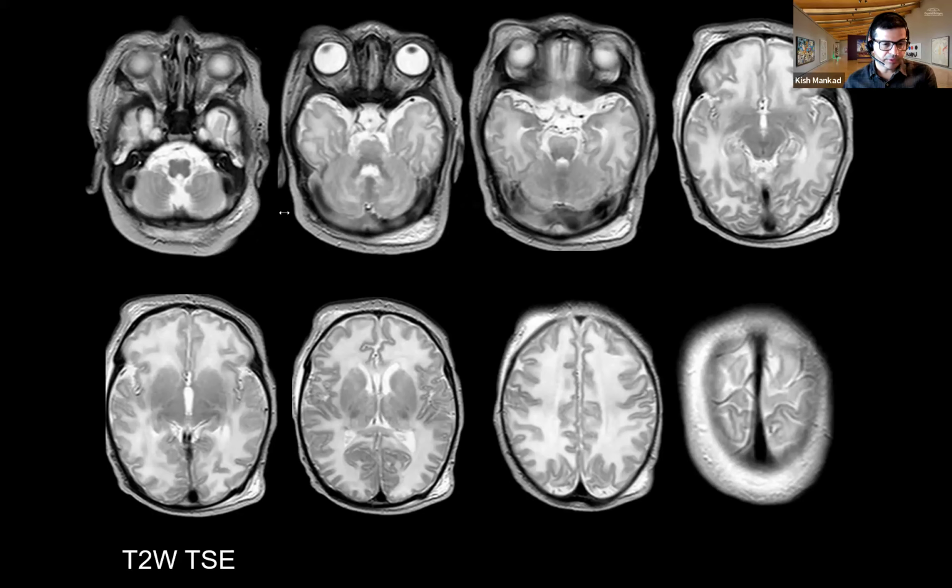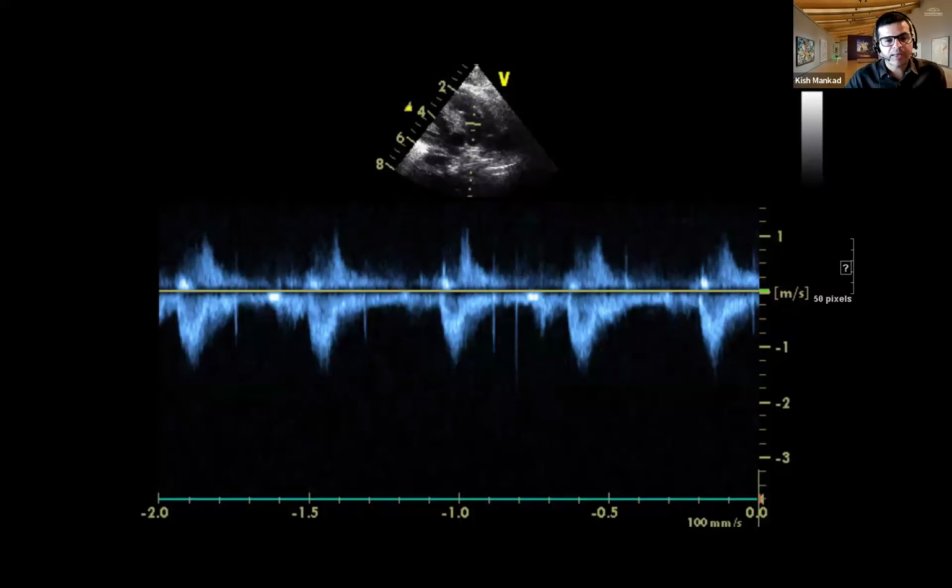And DSA, Dr. Sami said, digital subtraction angiogram is a very big undertaking. Any simpler test before that? Anything you could do on the bedside? And that is very important to remember because in neonates, you have a lot of potential with this modality of imaging. The answer is yes, ultrasound. And I think Dr. Sami gave the final kind of proof of life test with DSA. But one step before that would be to do an ultrasound scan.